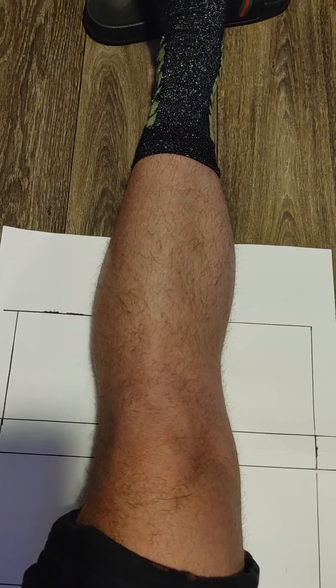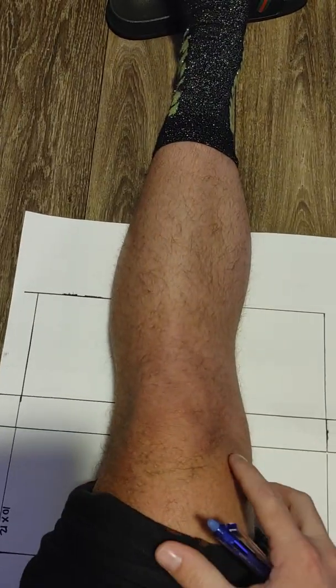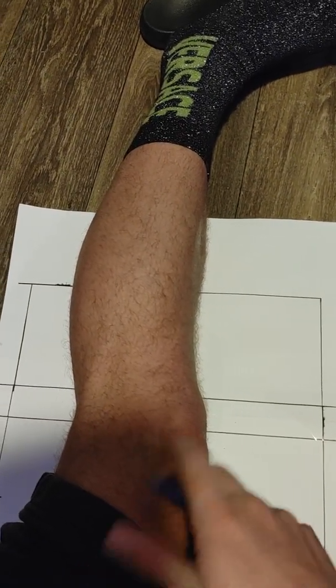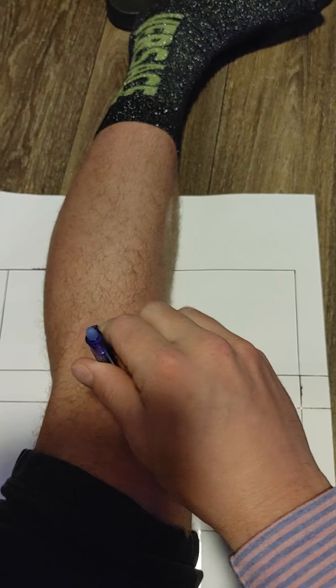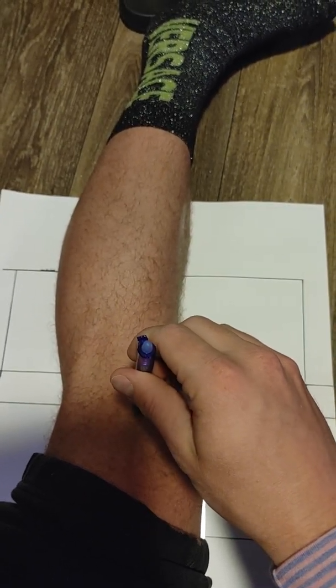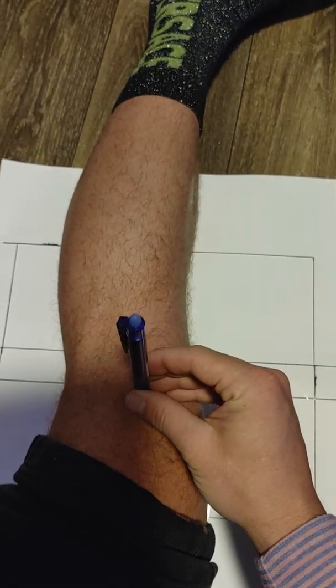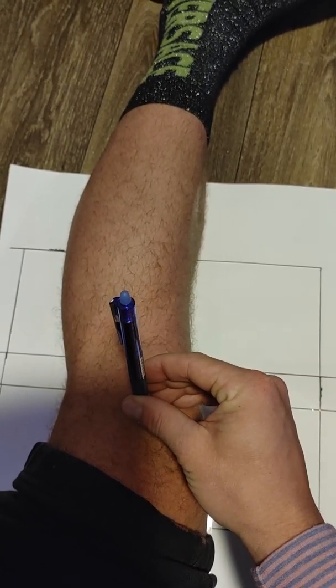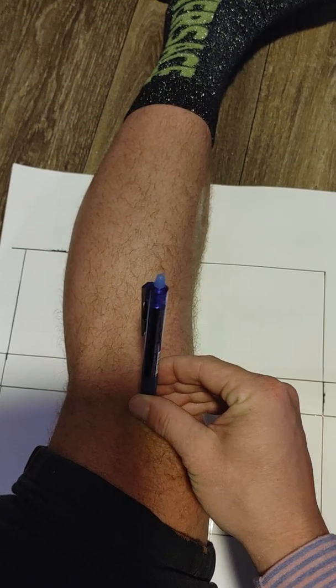Now we have the medial oblique view. The patient is going to have their leg rotated about 45 degrees. The central ray is going to be directed again at the knee joint space. And we're going to have that 3 to 5 degree tilt. That's because we are recumbent. Now, if we were standing, it'd be perpendicular.